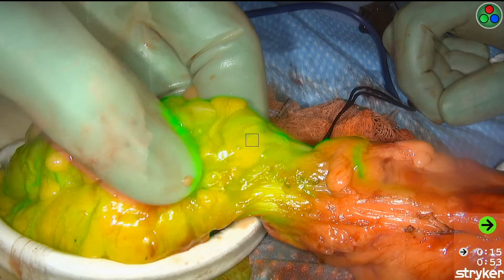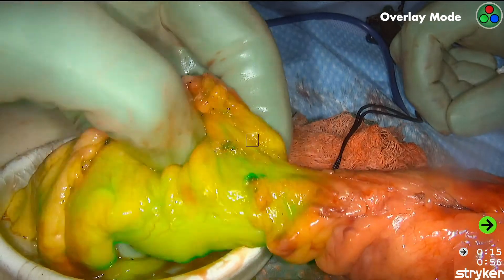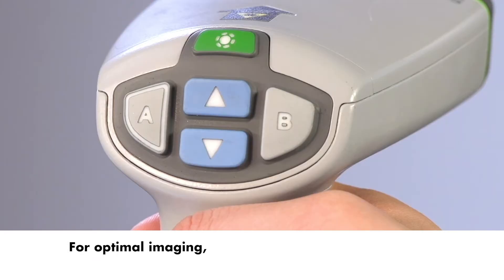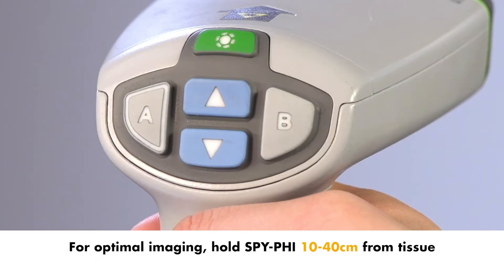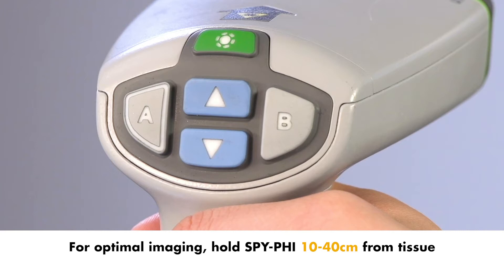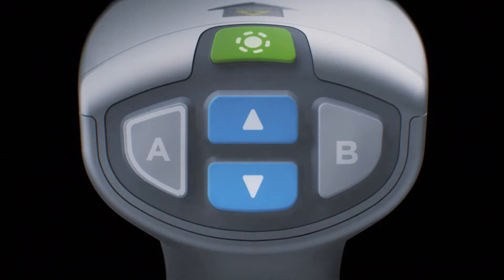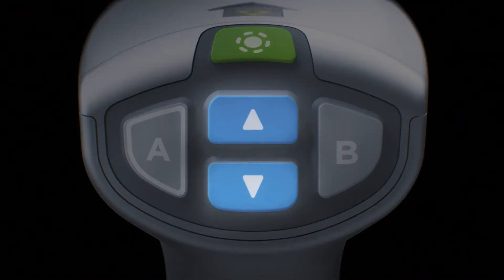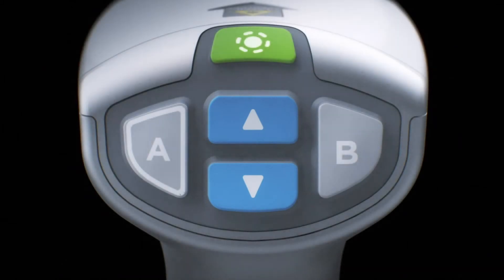The default display is overlay mode. For optimal imaging, keep the imager between 10 and 40 centimeters away from the tissue of interest. Focus the image by pressing and holding either of the blue buttons until a focused image is achieved.